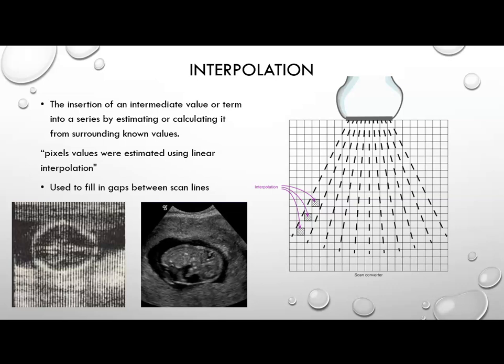And you can see that the picture on the right looks significantly better than the one on the left. Interpolation, though, is not an increase in the number of scan lines. It's simply a mathematical technique to make the number of scan lines appear as if it's got higher line density. So it doesn't affect your temporal resolution. In fact, it makes it very good.